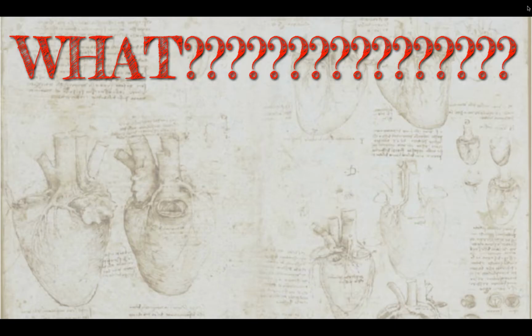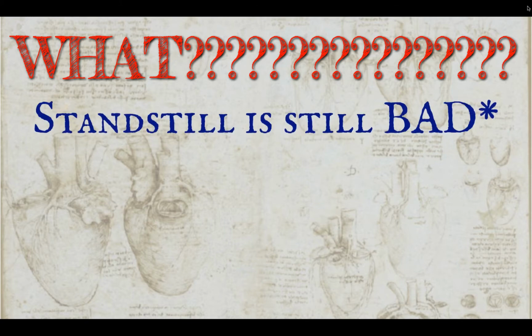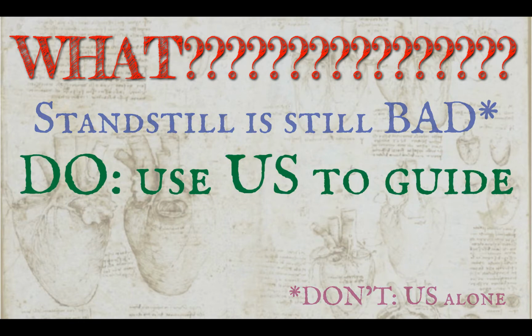So, what? Let's listen up here for a second. First, this trial did show something we've all suspected and have relied on in our resuscitation. It definitely showed that cardiac standstill is very bad. It just asks us not to rely on this alone and use the rest of the clinical picture to guide management. And we'll talk in a moment about how to delay the decision to stop the code while you synthesize that same clinical data. We also learned from the Reason Trial and some of its post hoc analysis that when ultrasound is used to guide resuscitations, you can get markedly improved results.